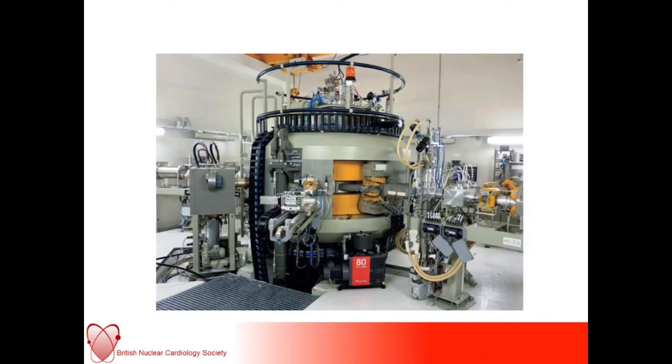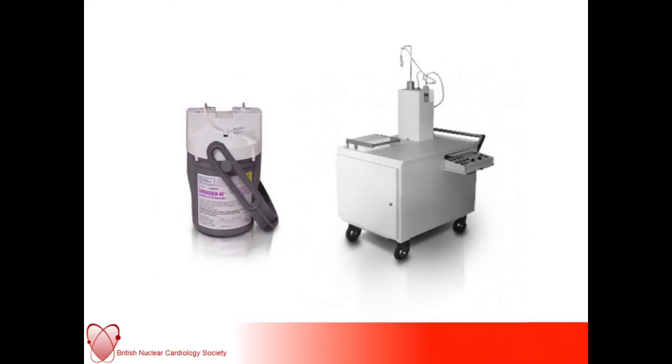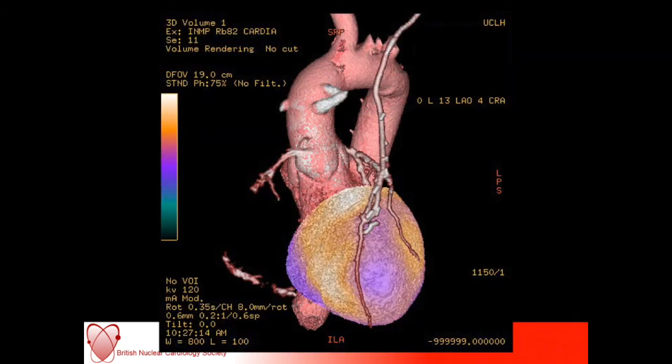Just for illustration, this is a cyclotron, so it's a pretty serious bit of kit. And this is what a rubidium generator looks like, and it's about the size of a shopping trolley. You can sit at the end of the scanner and can deliver a tracer literally 24/7 on tap. And of course, because as I've alluded to the fact that these are PET CT machines, it means you can combine the PET perfusion with CT angiography. In this case, in this graft patient, where many of the saphenous vein grafts have been occluded, the LIMA is still working, and yet there's still some distal ischemia, presumably in that LIMA territory.